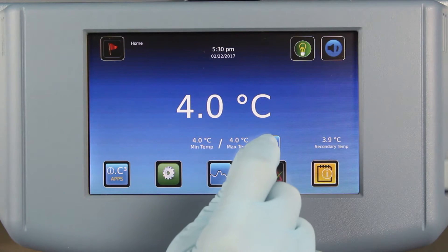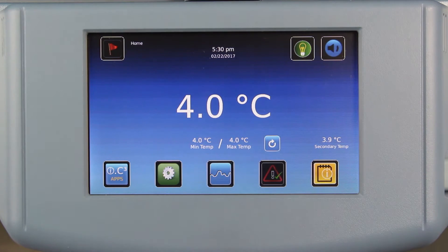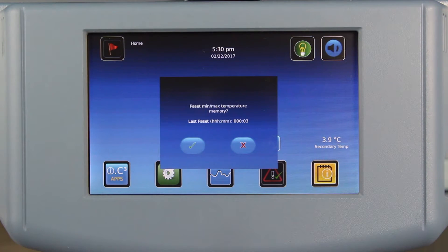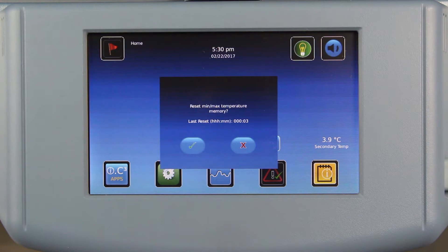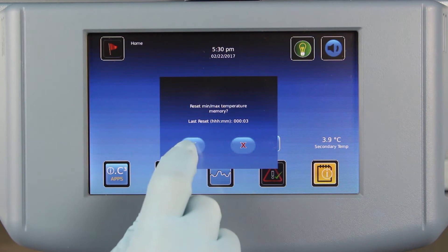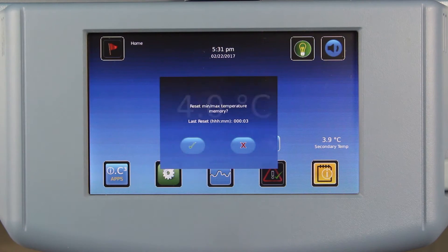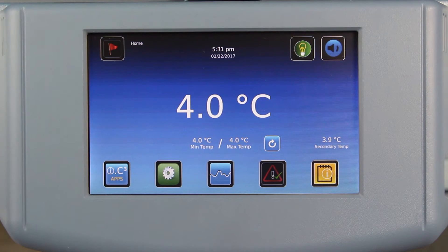This feature also enables users to reset the min-max temperature memory and start a new recording period. Pressing the Reset button brings up a confirmation screen, which shows how much time has elapsed since the last reset.